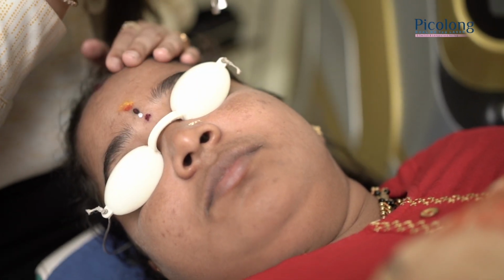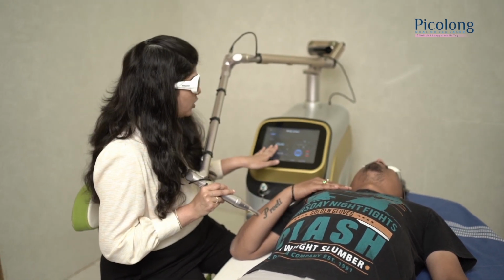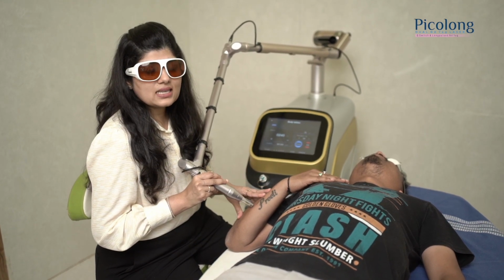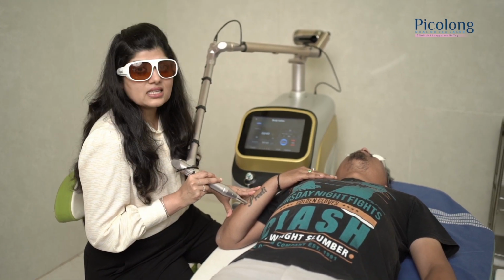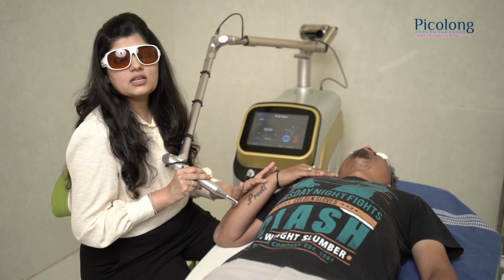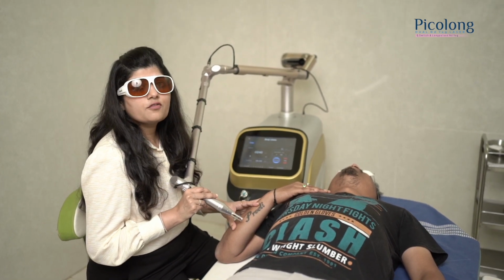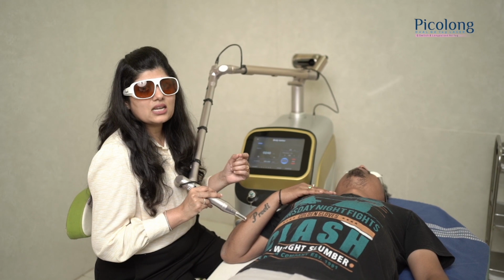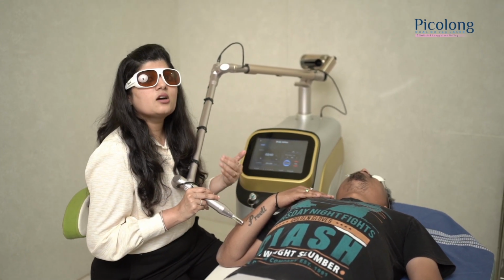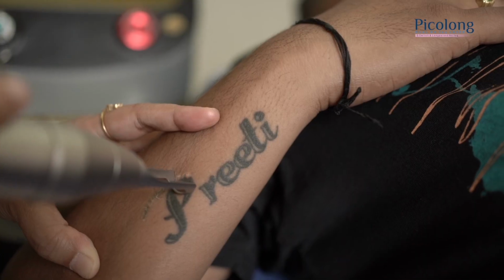Always ask if the patient is comfortable. Here I am using it on a tattoo with an energy of 240 and a spot size of 5 mm. Keep a larger spot size and see if the color disappears, and there shouldn't be any frosting. Usually this is a professional tattoo and it's a black ink, so I'm using 1064. If it is a hand tattoo, which was the conventional tattoo they used to put in olden days, it might take a few more sessions because there is no precise depth.